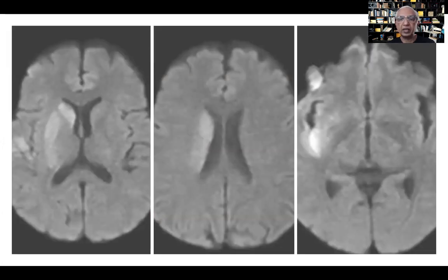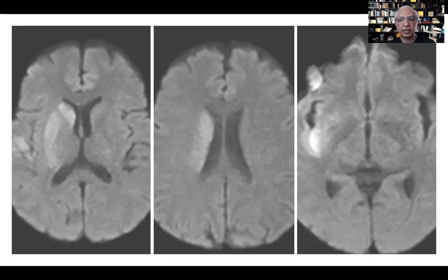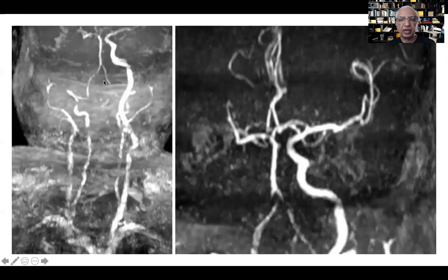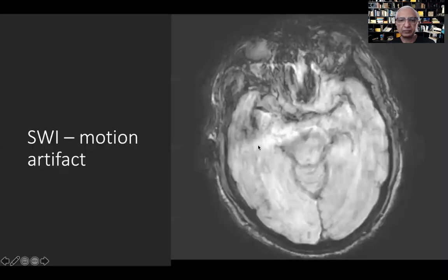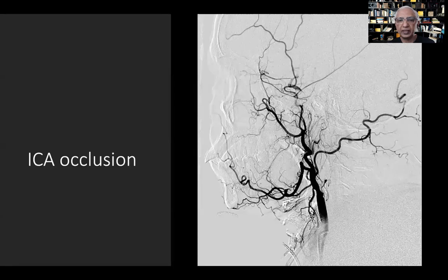We start with MR and see diffusion restriction along the lentiform nucleus with the internal capsule spared, some changes in the caudate nucleus and insular cortex, all on the right side. The ASPECT score is within limits and none of these are eloquent areas. The MR angio shows the ICA occluded from the origin on the right side, with the ACA filling from the opposite side but no MCA filling. There is a little streak of contrast beyond the occlusion with nothing seen distally.